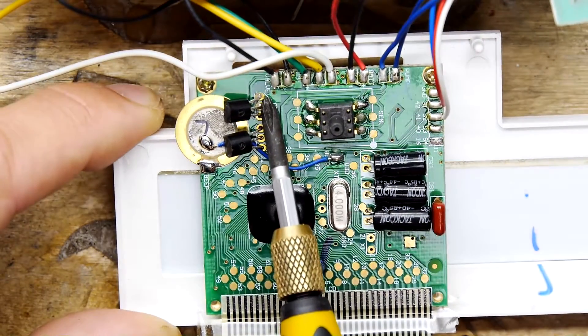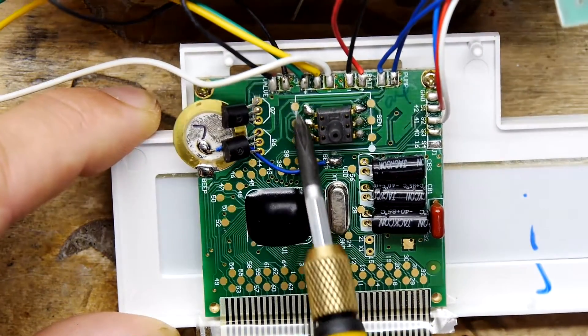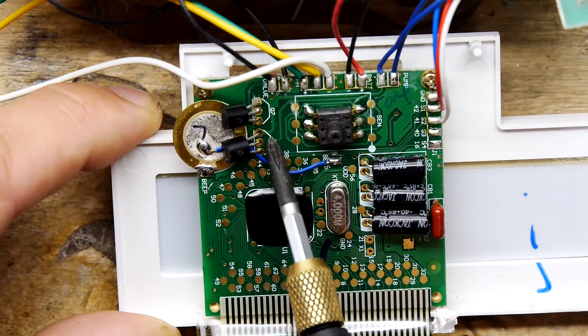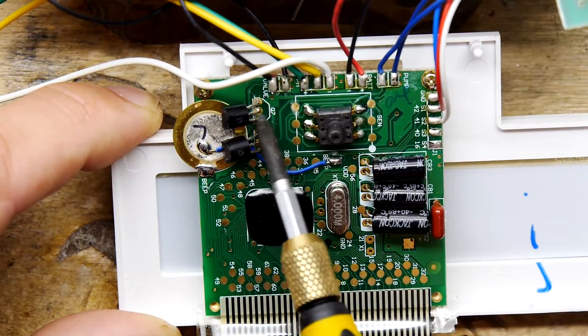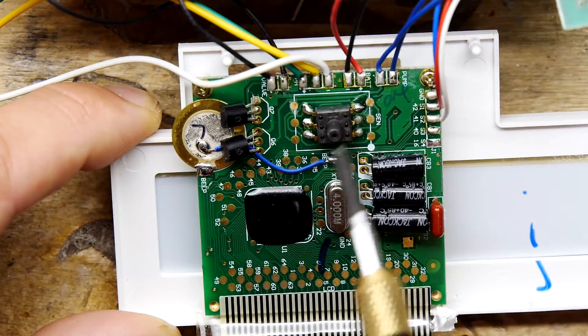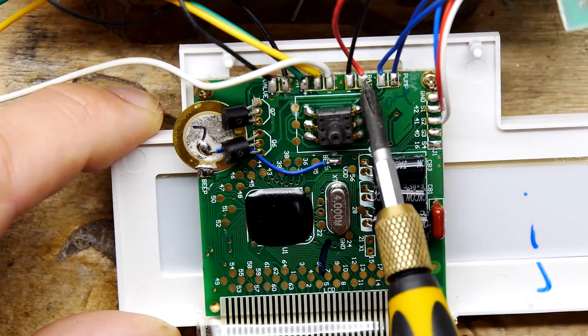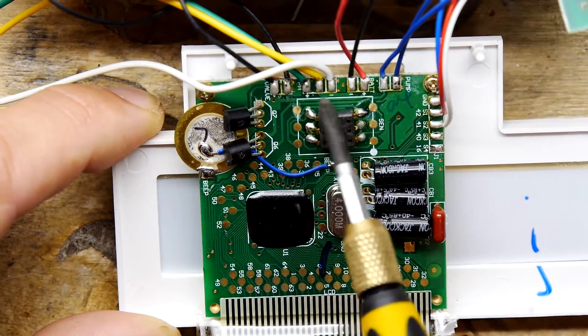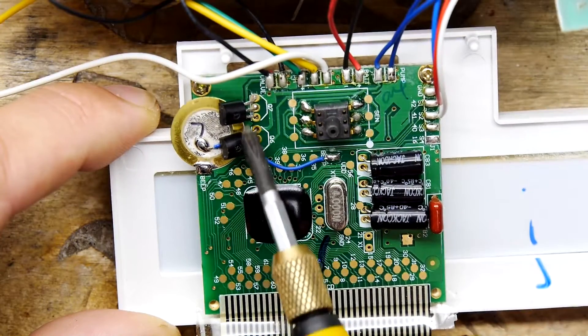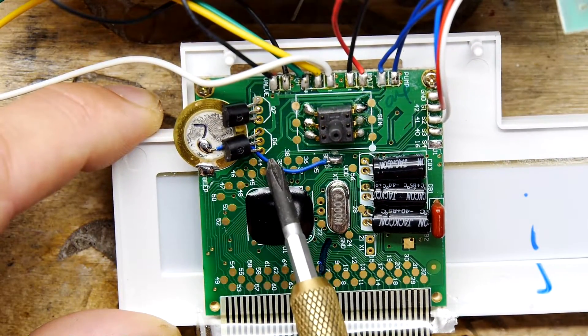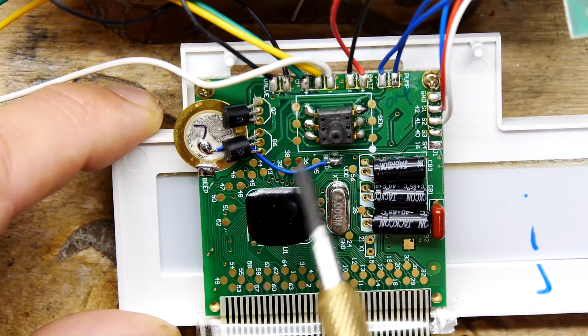So you see here, it actually says on the PCB valve. So that's the valve one. And I can see the traces of this transistor going over that way. And I can see the traces of the pump going to this. So these two transistors are for the pump and the valve.